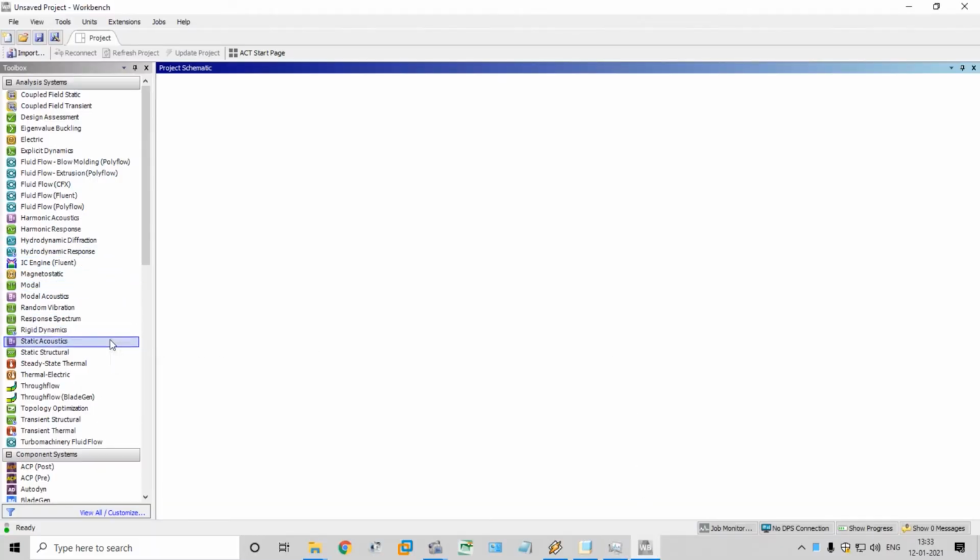Opened. So we are going to analyze the force factors: how much force is going to happen in the bone, stress, strain. So static structural. Just double click the analysis system, static structural.